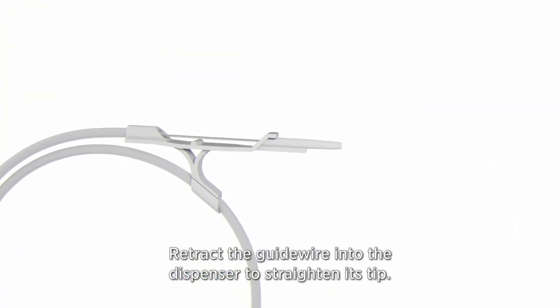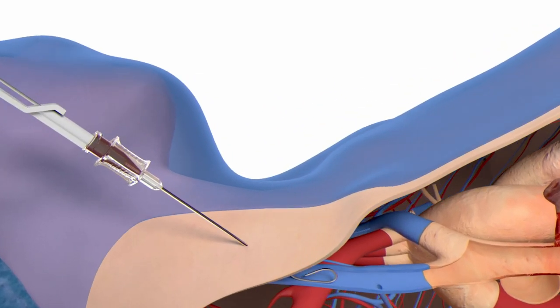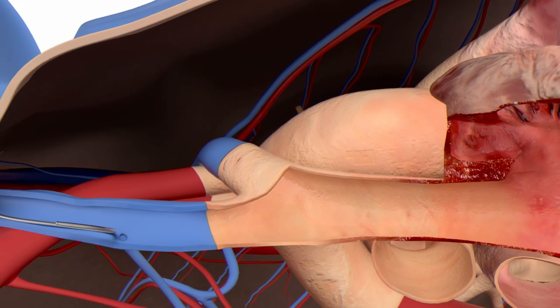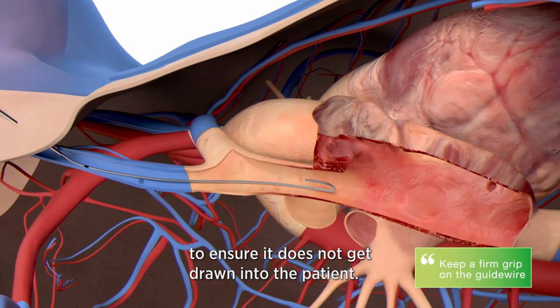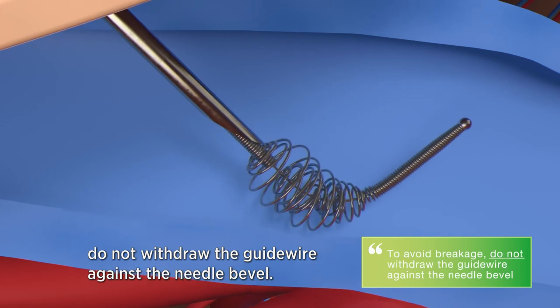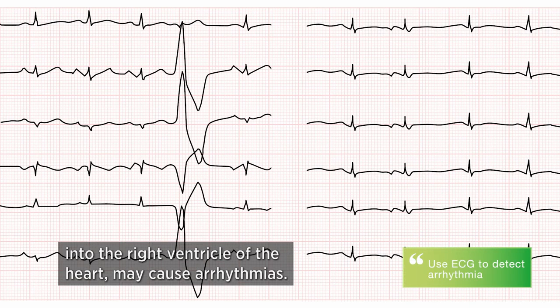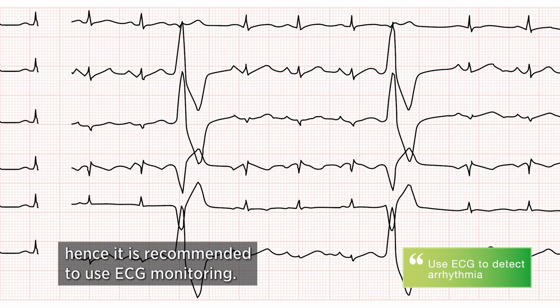Retract the guide wire into the dispenser to straighten its tip, then gently insert the tip through the needle into the vessel. If resistance to the advancement of the guide wire is encountered, withdraw it, twist it slightly and gently try to reintroduce it. Advance the guide wire to the required depth and maintain a firm grip at all times to ensure it does not get drawn into the patient. Do not withdraw the guide wire against the needle bevel. Advancement of the guide wire too far into the right ventricle may cause arrhythmias, so ECG monitoring is recommended.